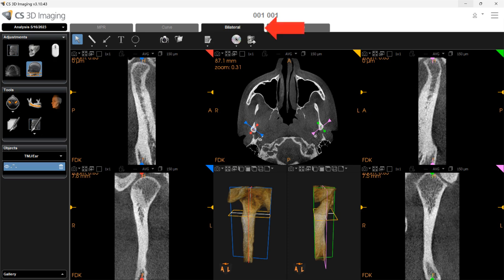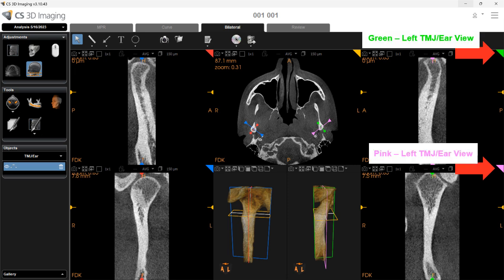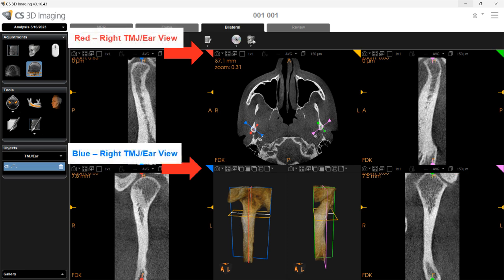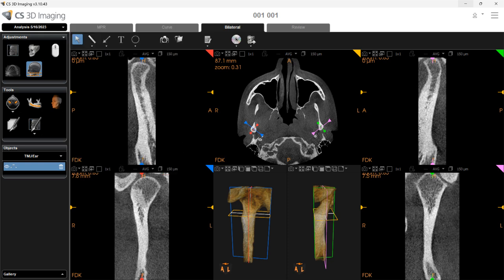Under the Bilateral tab, you can examine specific regions of interest in depth, specifically the TMJ or ear. The view screens that appear depend on the type of acquisition used. The bilateral tab has a green and pink tag that represent the patient's left TMJ or ear view. Green moves through slices going anterior to posterior through the joint, and the pink slices move right to left. The red and blue tag views represent the patient's right side. Red moves through slices going anterior to posterior, and blue moves through the slices right to left. These view screens appear when you draw a trace on the axial slice view.